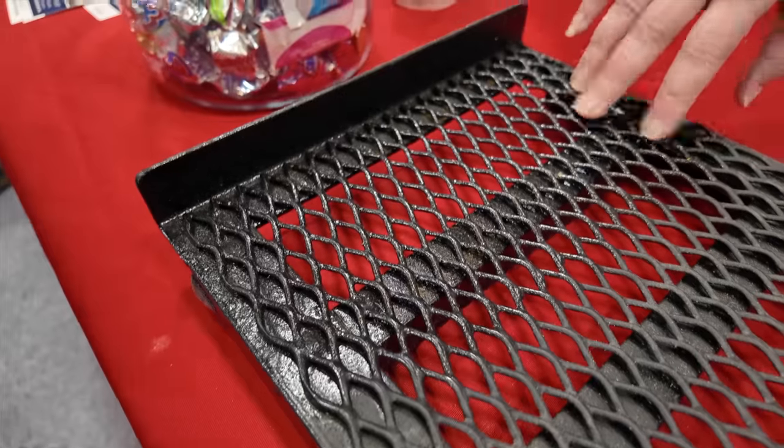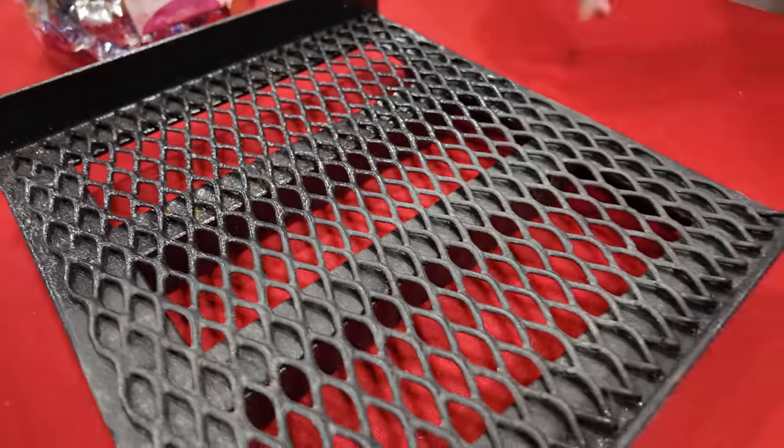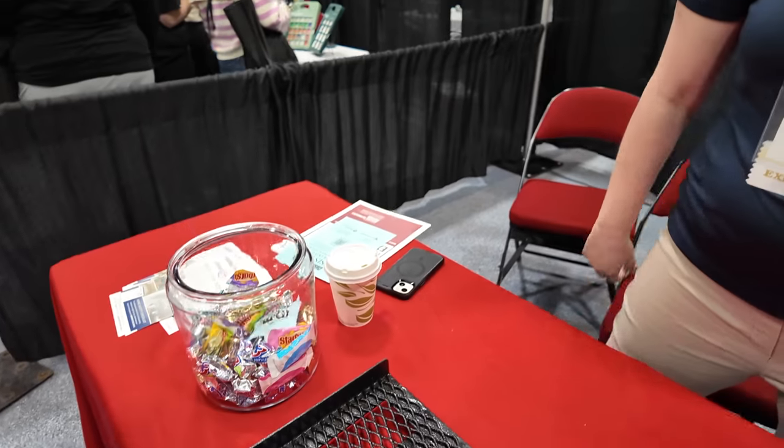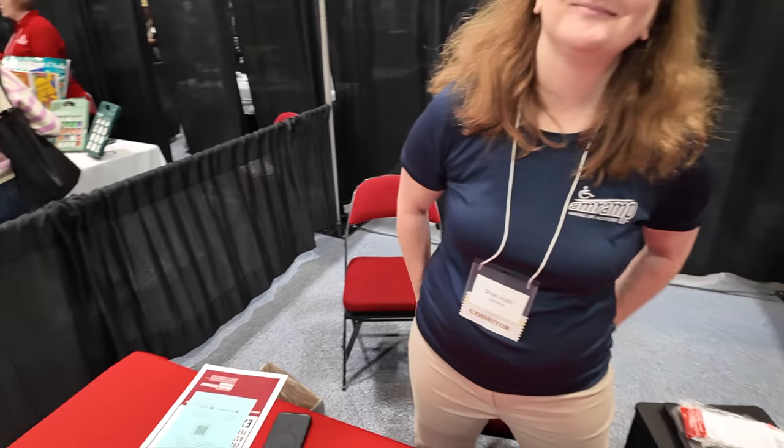Marvelous. And this is going to be an example of some of the construction of the ramp. This is what it looks like. We have an expanded metal. The ramp is all steel. So that allows for that rainwater to pass through. And you all are able to come out and do evaluations to see what's going to work, how much I need, and give me an idea of what the timeline will be as well.